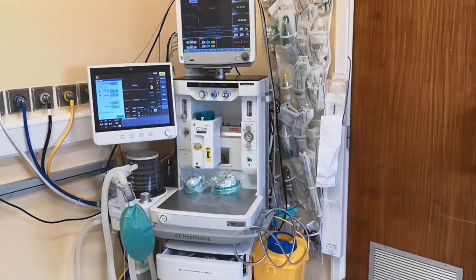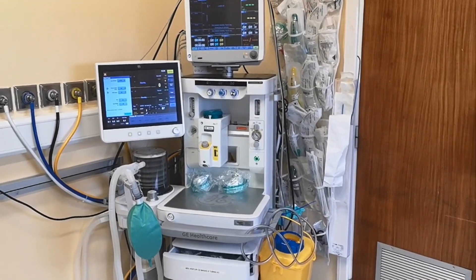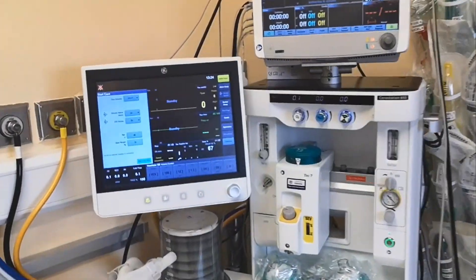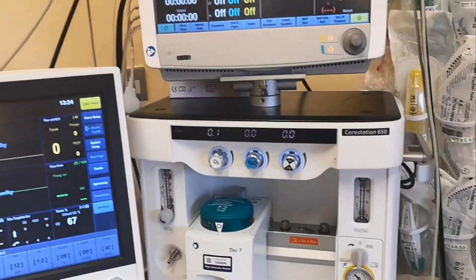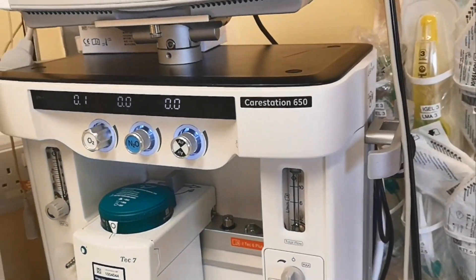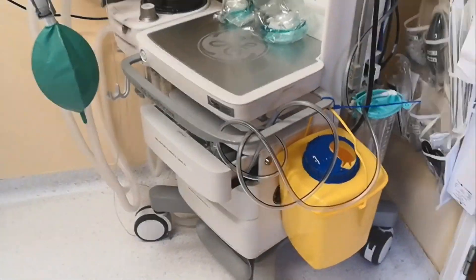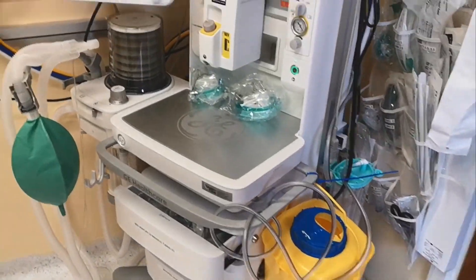All right, let's familiarize with this other machine. It is called the GE Care Station 650 — another ventilator we use in theaters.